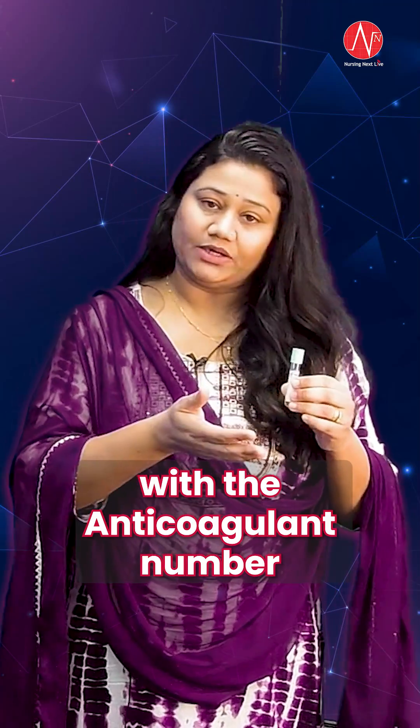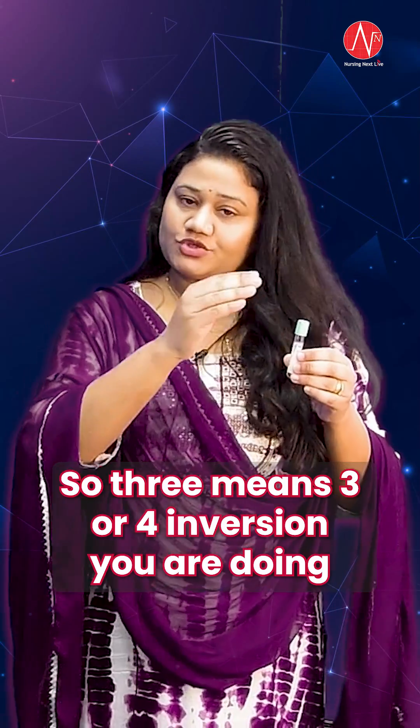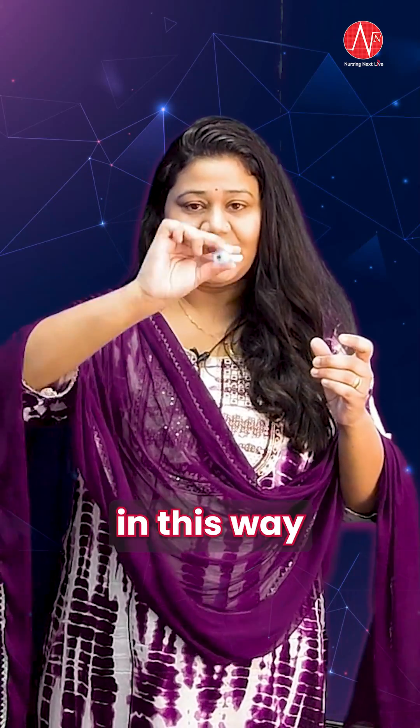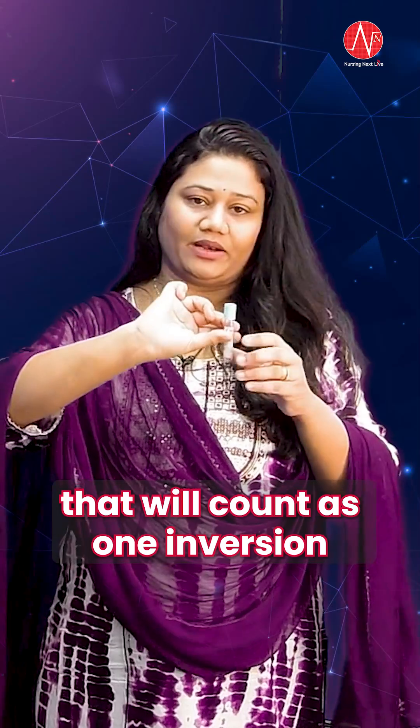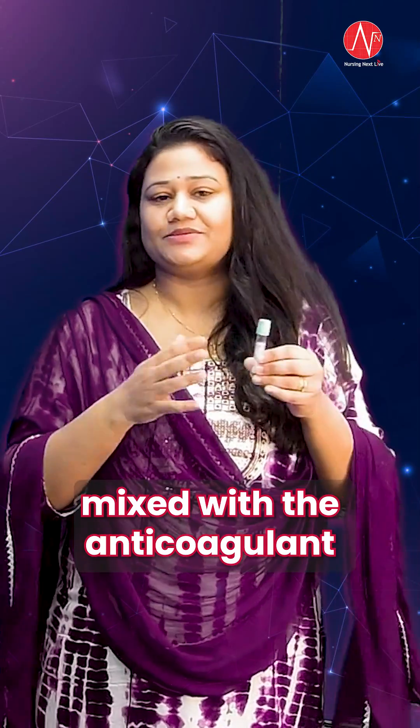You can remember the inversion count with the anticoagulant percentage number — 3.2 means 3 or 4 inversions. When I say inversion, that means turning the tube this way, which counts as one inversion. We do the inversions in order to let the blood sample mix with the anticoagulant.